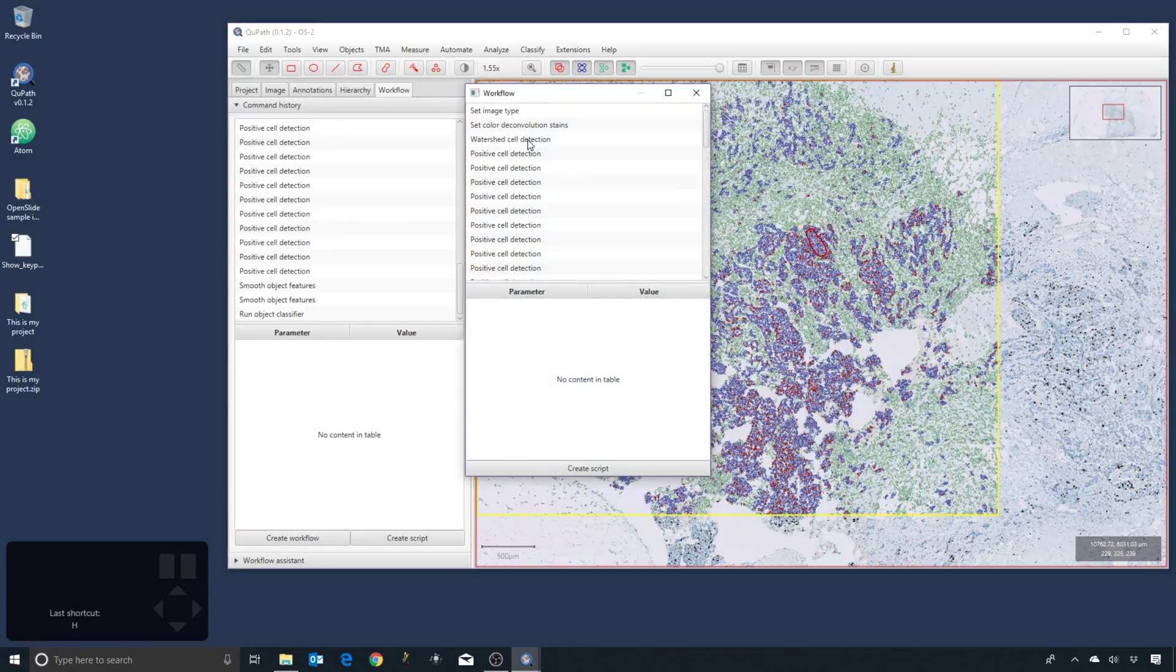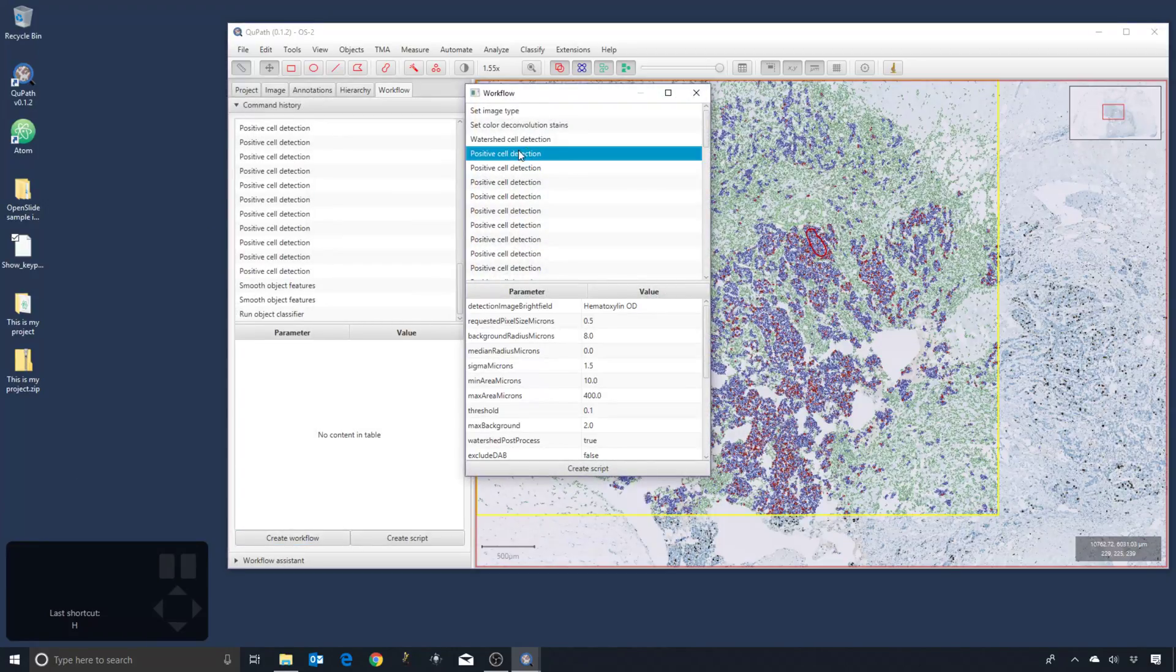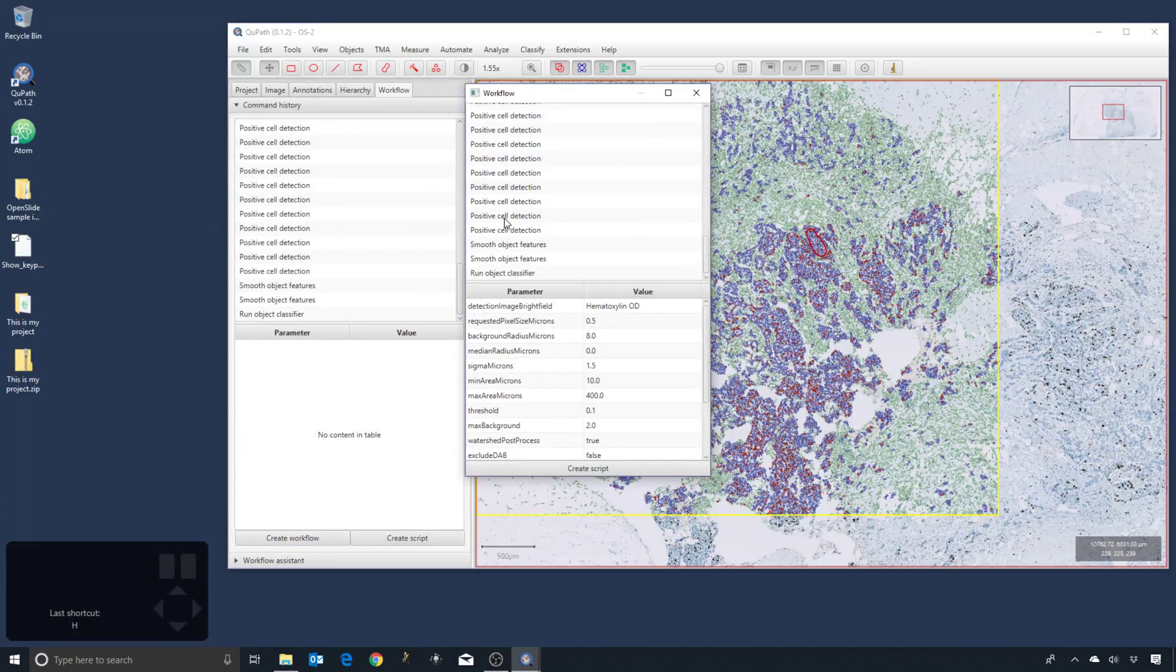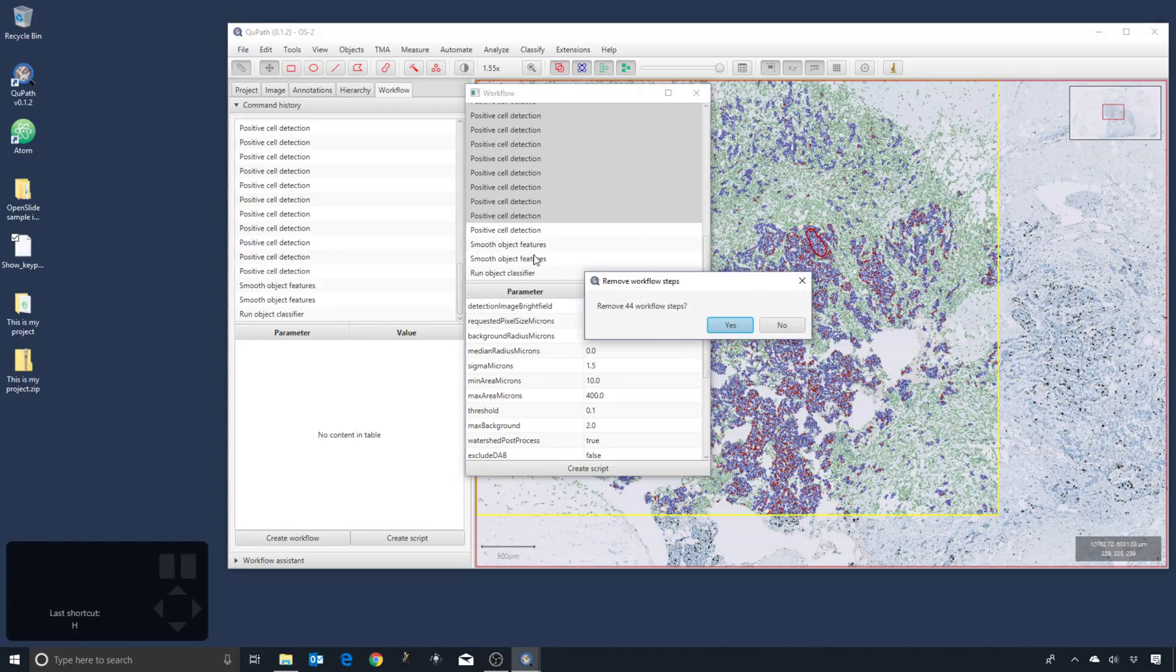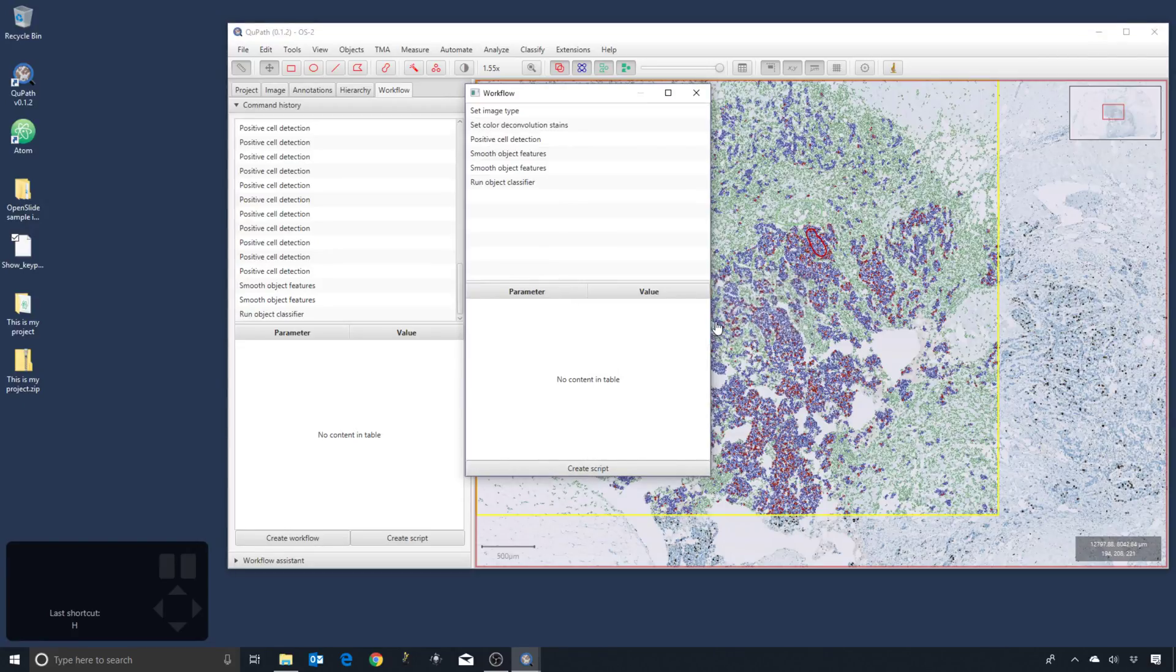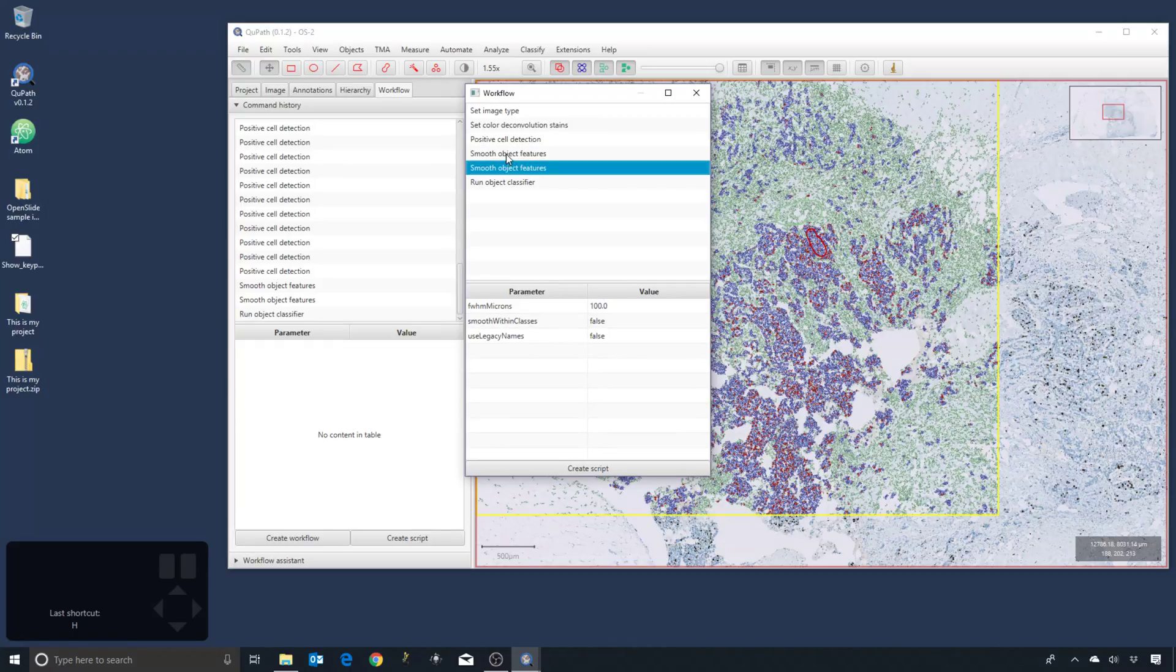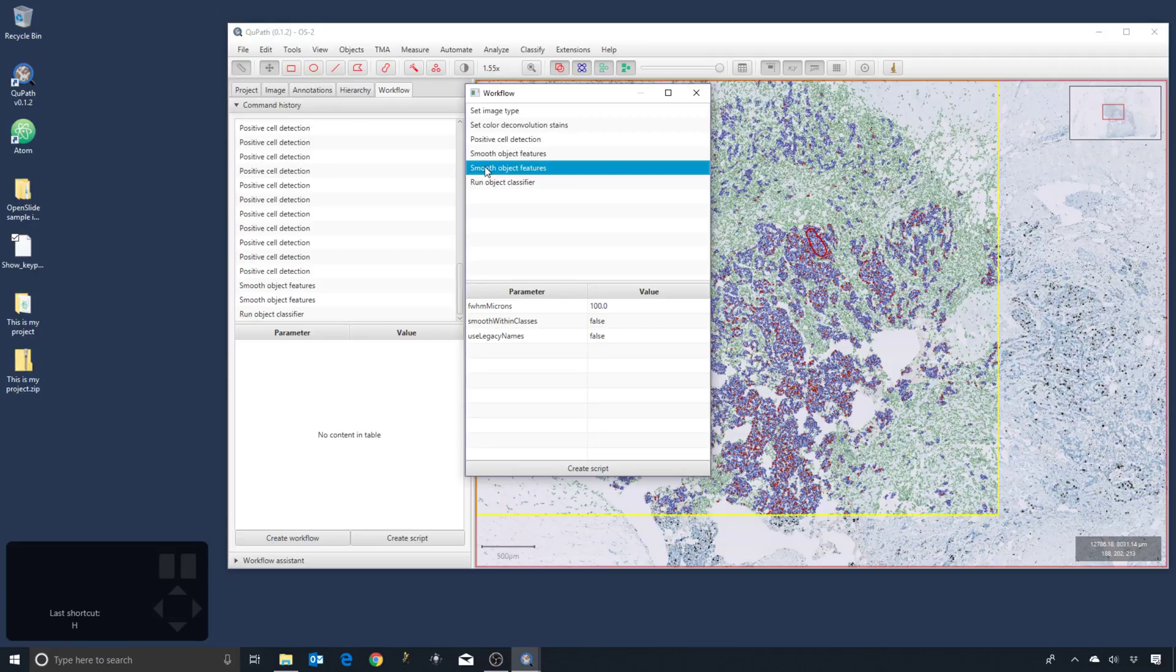We press 'Create Workflow'. We can select all of the times we ran positive cell detection and didn't want it, right-click, remove selected items. See, we ran smoothing twice but we didn't actually use any of the features.